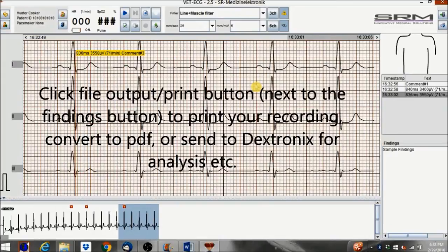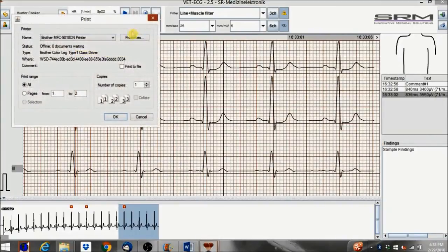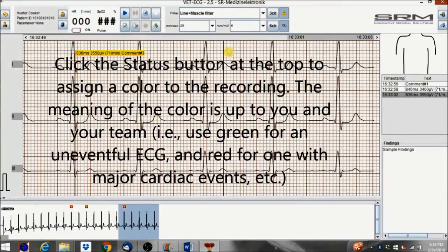Click the file output/print button next to the findings button to print your recording, convert to PDF, or send to Dextronics for analysis, etc. Click the status button at the top to assign a color to the recording. The meaning of the color is up to you and your team — for example, use green for an uneventful ECG and red for one with major cardiac events.